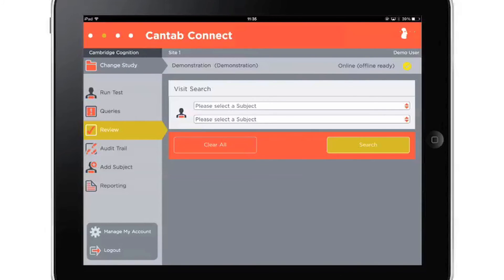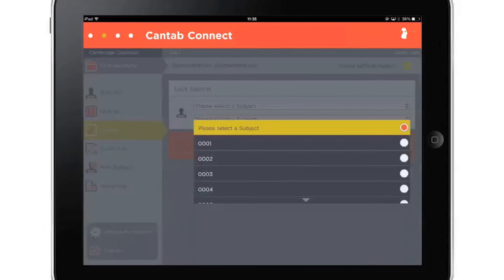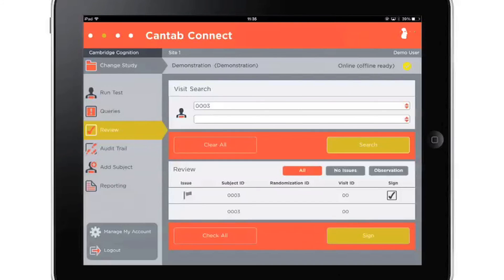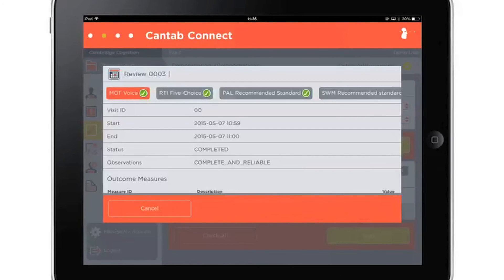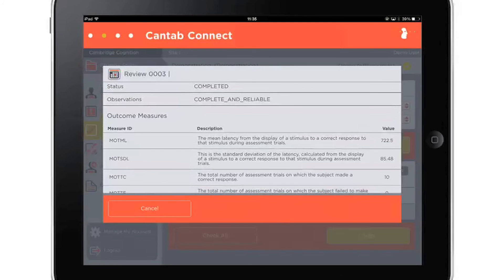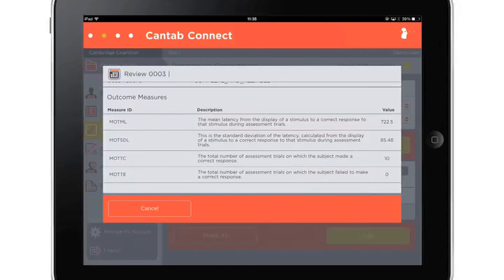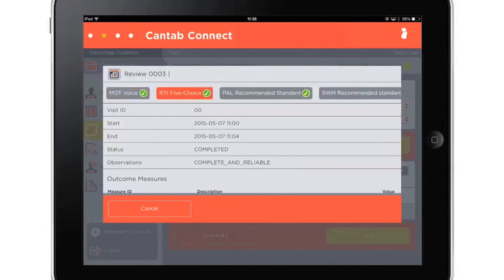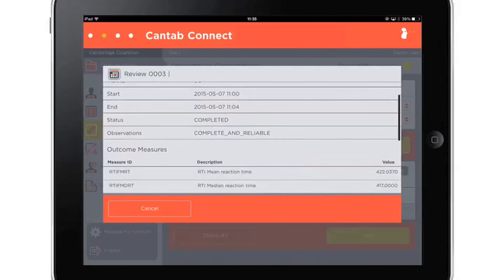Data can be accessed through the study in real time. To access data, simply select a report format and a CSV file will be generated, ready to be interpreted or imported into a statistical package for further analysis. A cleaned final data set will be provided for statistical analysis by our data management team at the end of the trial.